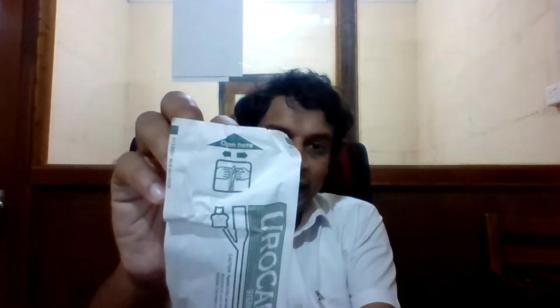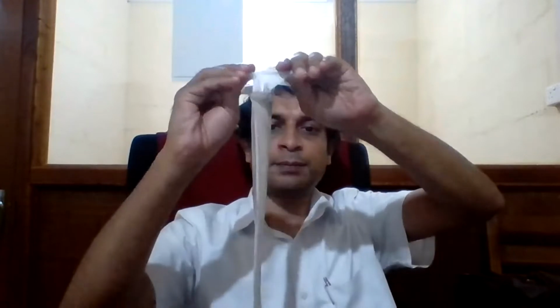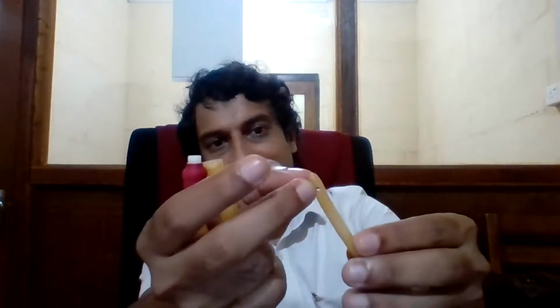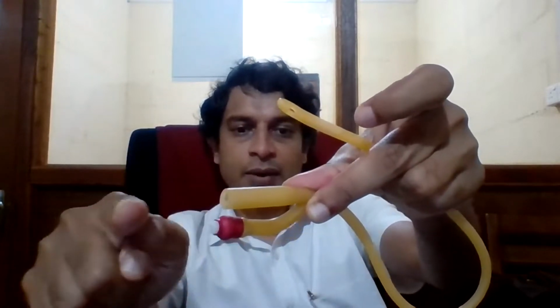Again, here it says open here. There is a sign for the kind of peel open that we talked about earlier, and you can open it up like that. And again, you've got an inner tube. I'm going to break sterility now and take this out. So this is the catheter. If you open up the inner tube, you can see that it's the catheter. So from this eye with the side holes, this is where the tube starts, which comes out of here. So you connect this into the urine bag, and the urine will flow out like this. This is the valve for the balloon.